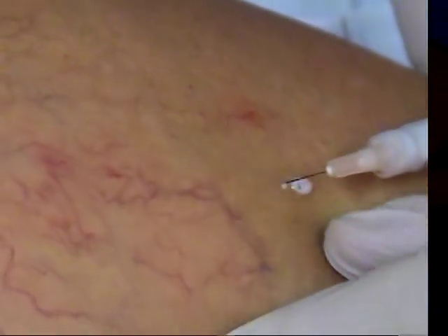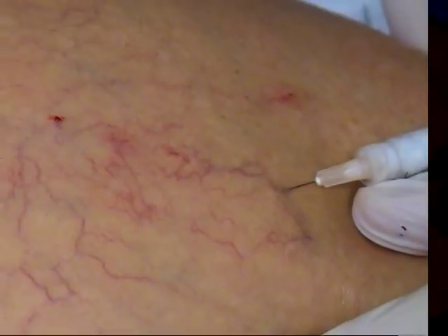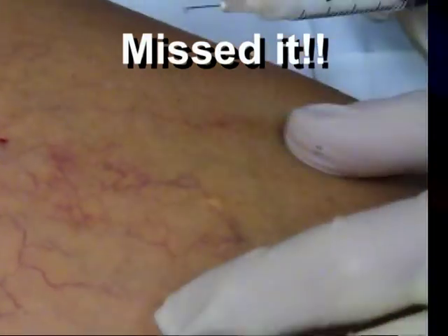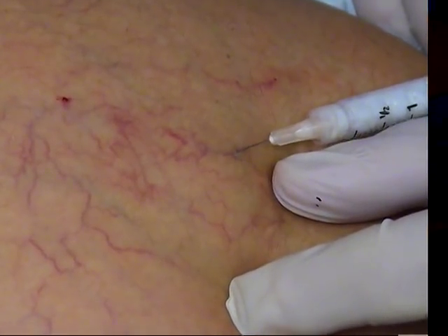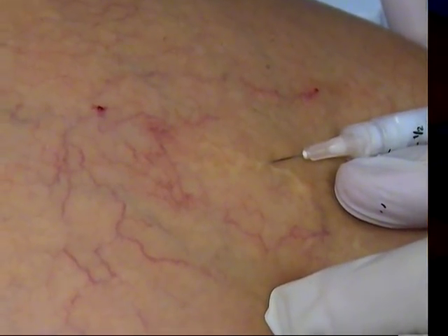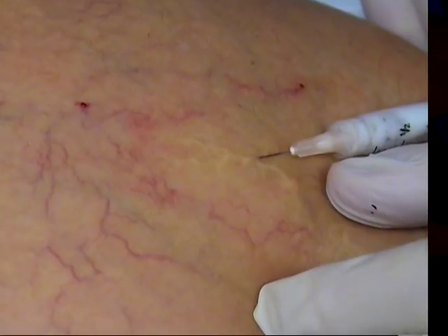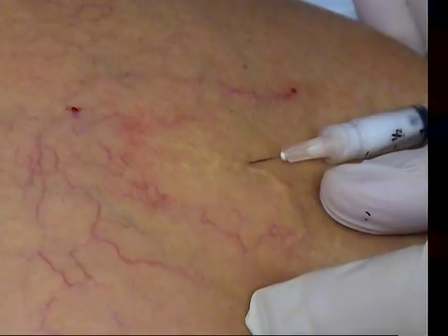Let's go in here — nice deep one here. Now there I'm a bit worried about extravasation, so I'm going to come out. Let's go in here. That looks good. Now this stays foam for about a minute or two, and after that you find the foam is lost in the syringe, so if you want to come on out then probably foam it up again.